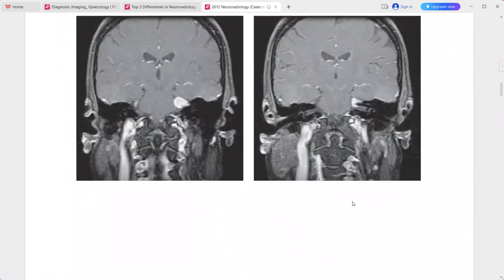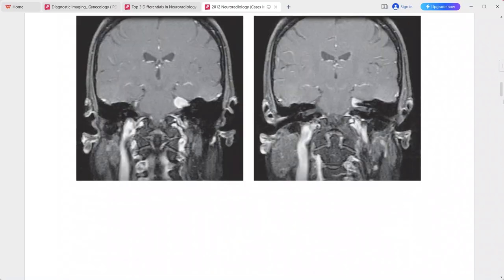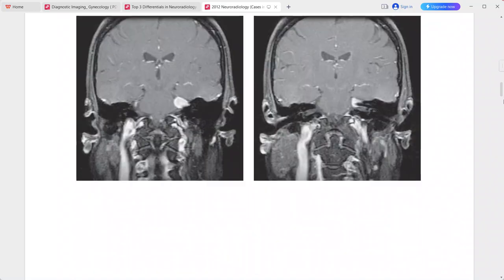There is a tail of dural enhancement extending into the internal auditory canal. This is characteristic of meningioma of the cerebellopontine angle. Differentials include vestibular schwannoma, metastasis, lymphoma, and trigeminal schwannoma.